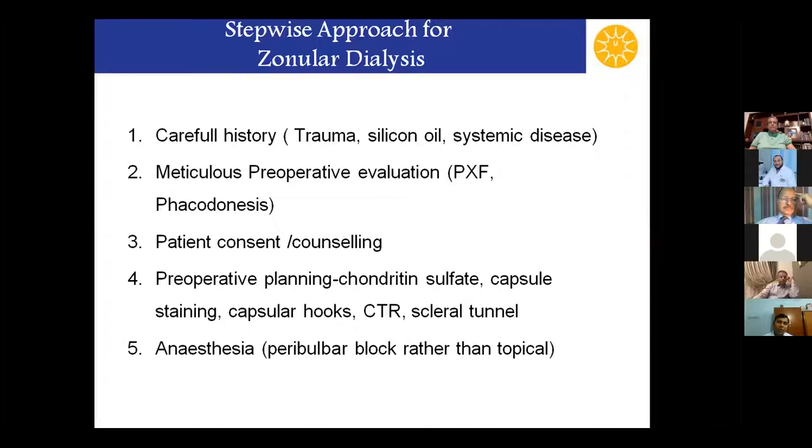So I am sharing my two videos. One is a hypermature cataract. I noticed the zonular dialysis during the phacoemulsification.